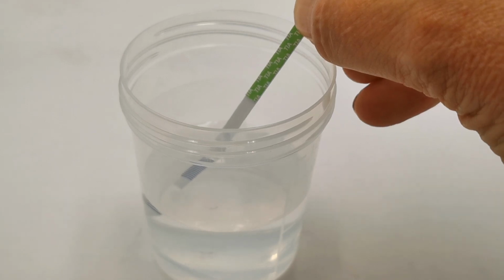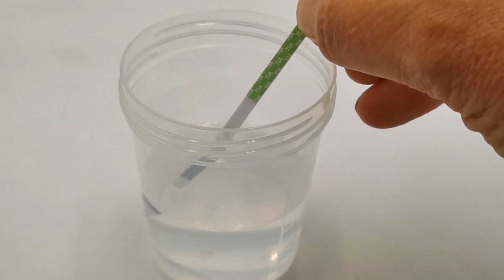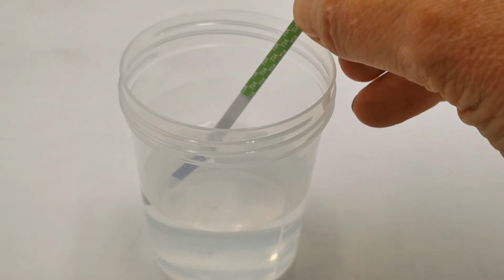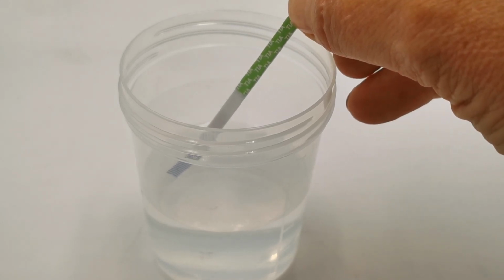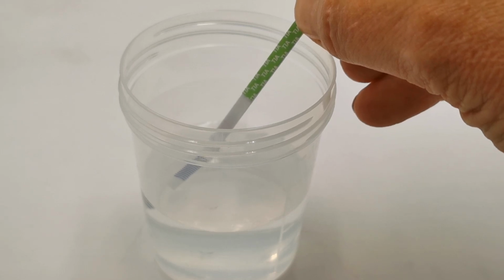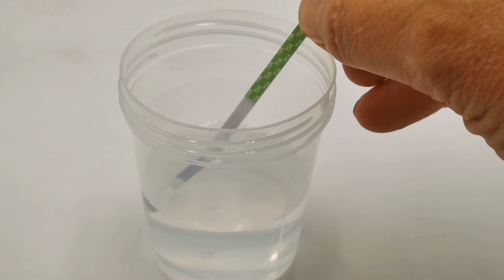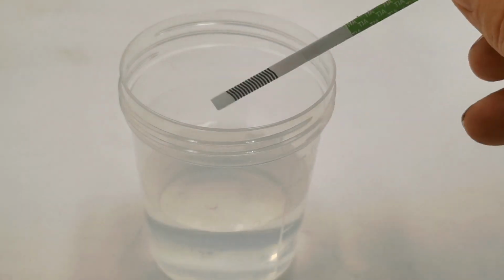So when you're ready to perform the test, simply dip the test strip to the top of those wavy lines and hold it in the sample for approximately 5 to 10 seconds, and you should start to see some wicking in that central flat section of the test strip after a few seconds. Just leave it there till you're confident that enough liquid has been absorbed.